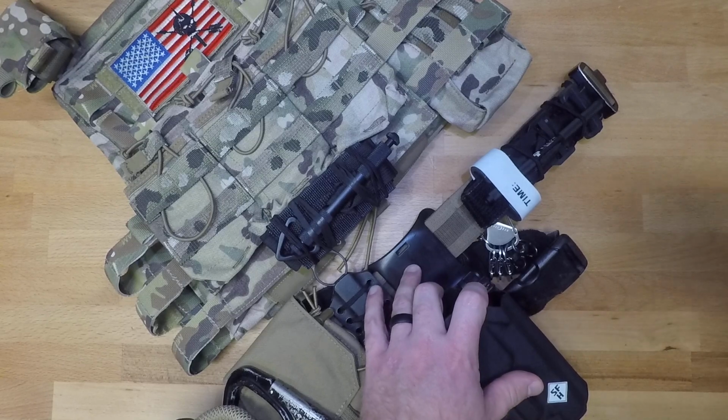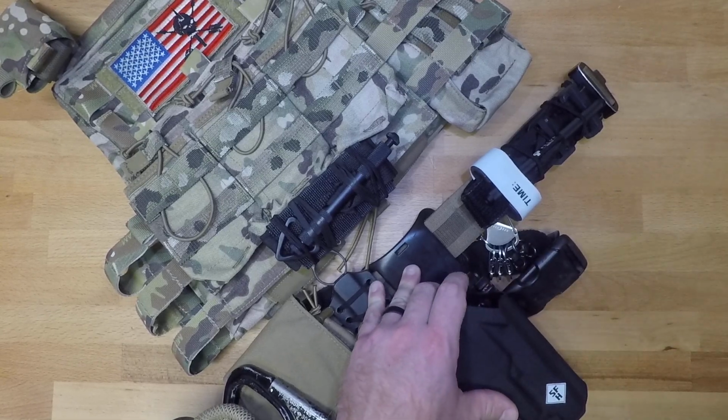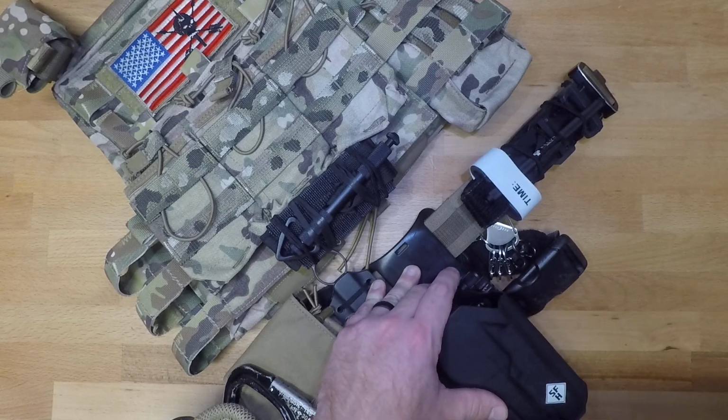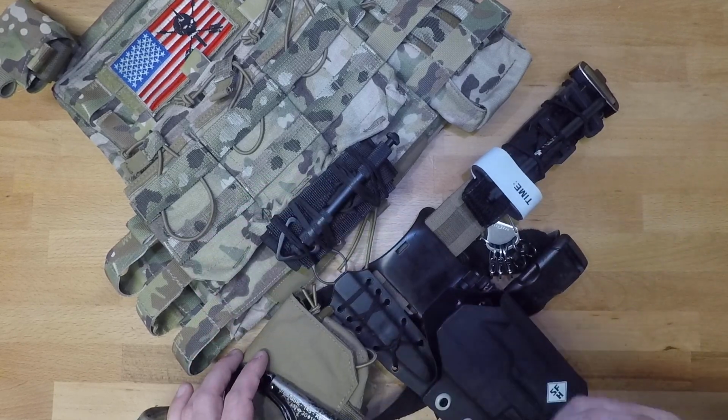And then when it comes to buddy aid, it is centrally located. You cannot miss it. It's impossible to miss a dude that has both of his tourniquets on the center of his kit, and then that individual can provide buddy aid and then render aid to help get that dude to the next level of care and save his life. Whether it's just a wounded limb or a completely severed limb, you want to stop those bleeds as fast as possible, and centrally locating your tourniquets is going to be key.